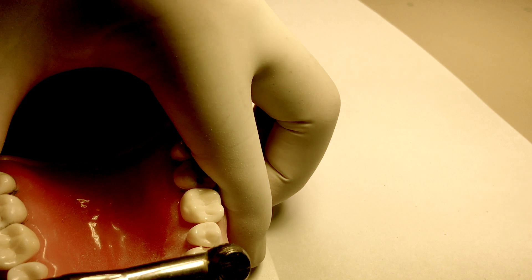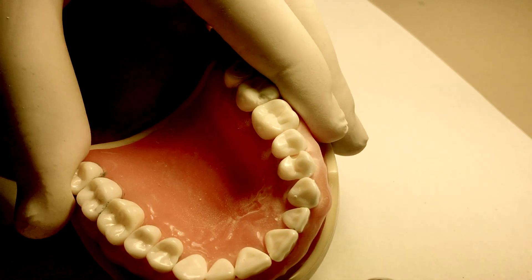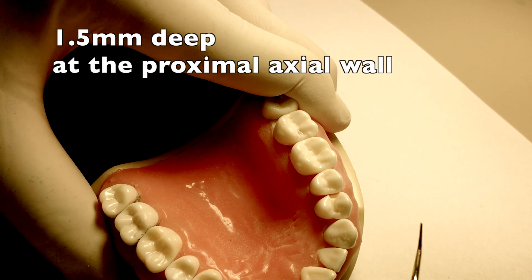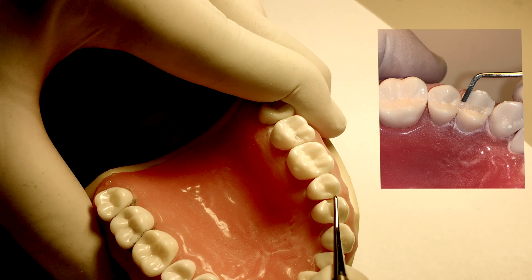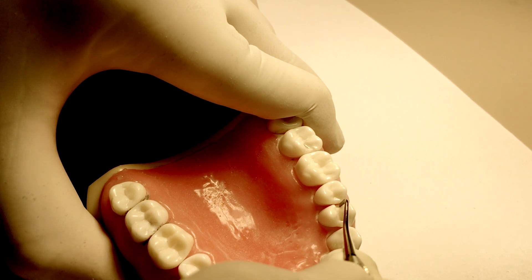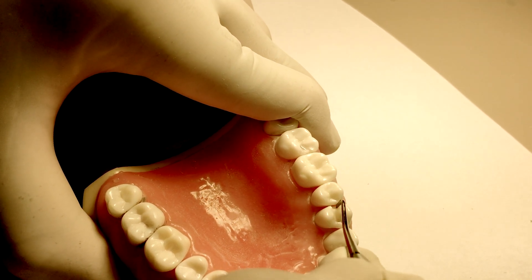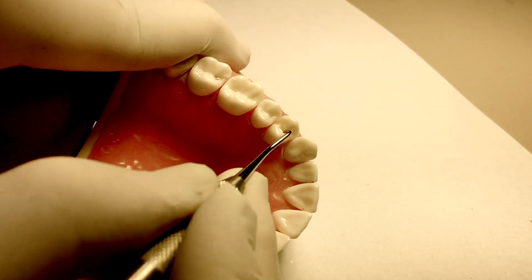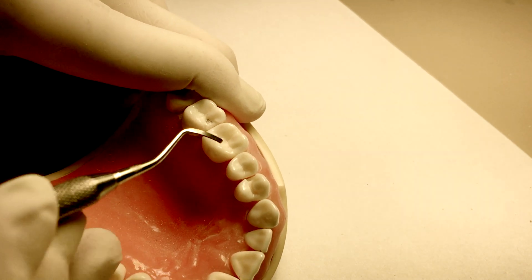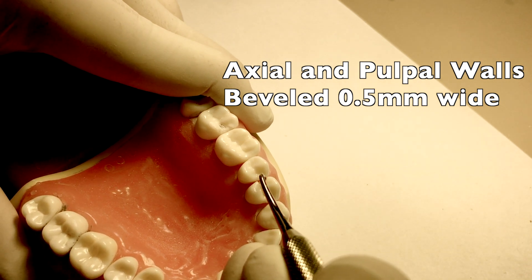The 56 carbide burr is great for smoothing out the pulpal floor and the gingival floor. The preparation should be approximately 1.5 millimeters deep at the proximal axial wall, and the hatchet is used to check that measurement. The remainder of the prep will be finished with hand instruments. The pulpal wall should be prepared to a uniform depth, usually flat and parallel to the occlusal table. The transition between the axial and pulpal wall should be rounded or beveled — if beveled, no greater than 0.5 millimeters wide, accomplished with a gingival margin trimmer.